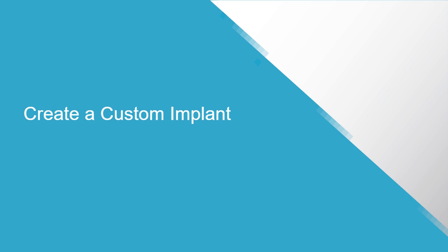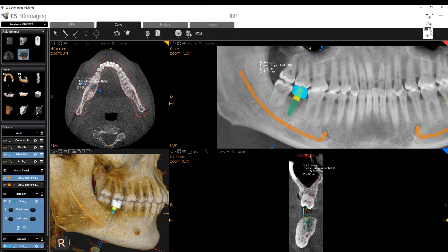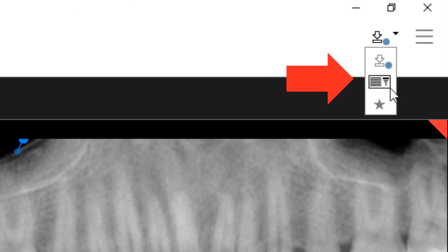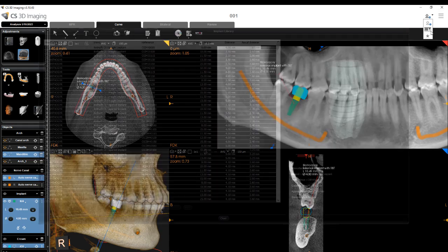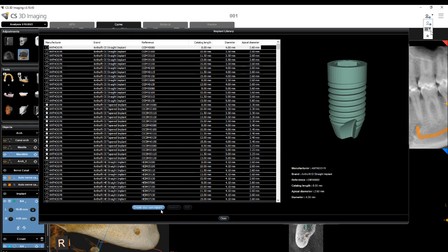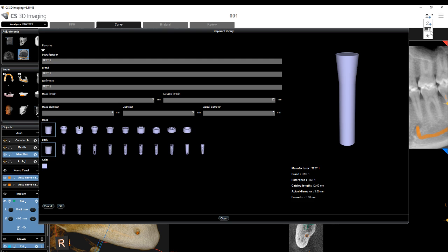Create a Custom Implant: To create an implant, select here to display the implant library. The Implant Library window appears, showing the list of available implants and their details. In the Implant Library window, click Create Your Own Implant. The Implant Library window then displays fields for configuring an implant.